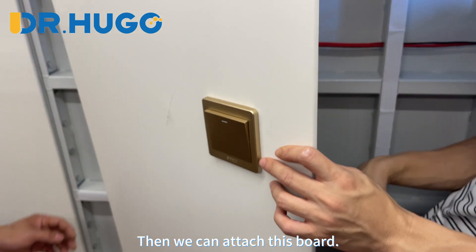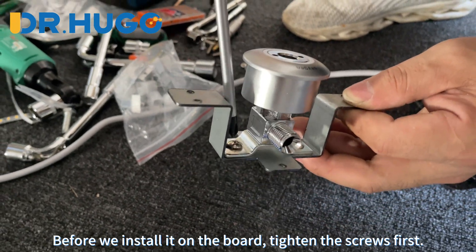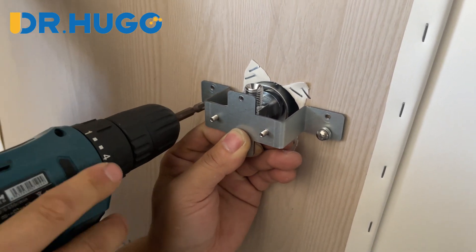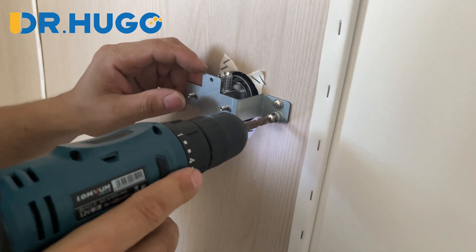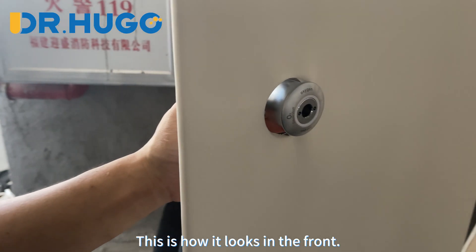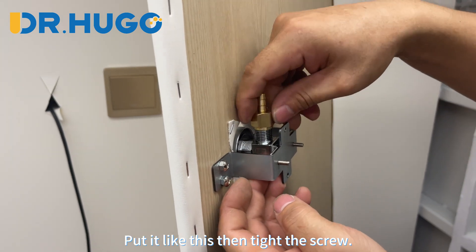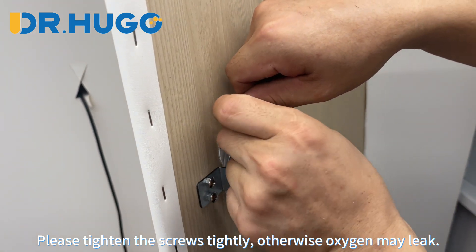Then we can attach this board. This is the connector of the oxygen humidifier bottle. Before we install it on the board, tighten the screws first. Fix this connector on the back like this — it is quite steady. This is how it looks from the front. Then we can install the connection part of the oxygen tube. Put it like this then tighten the screw. Please tighten the screws firmly, otherwise oxygen may leak.